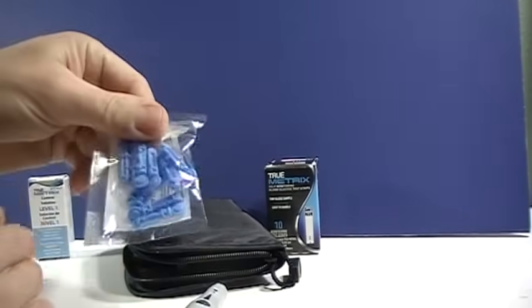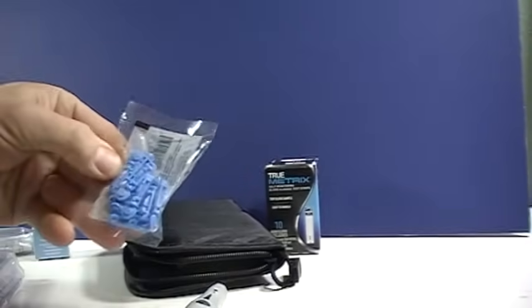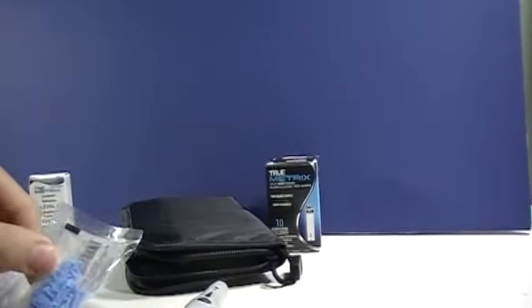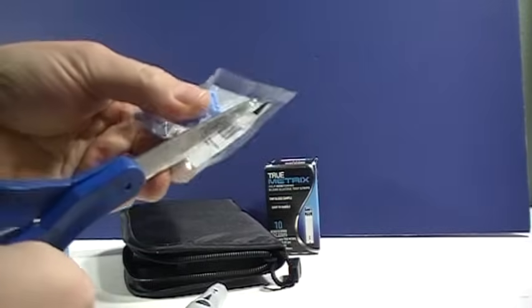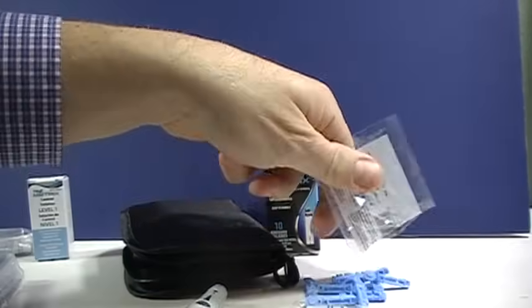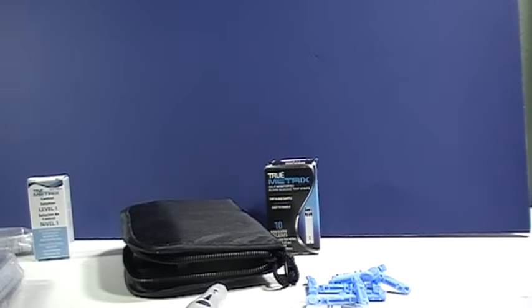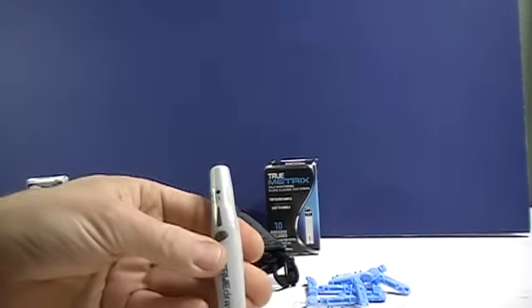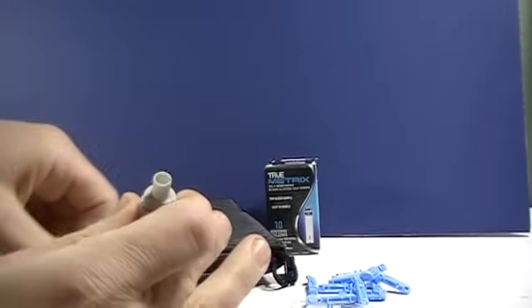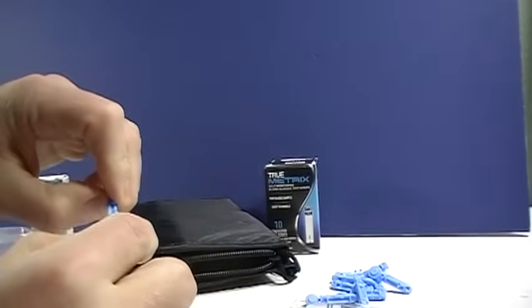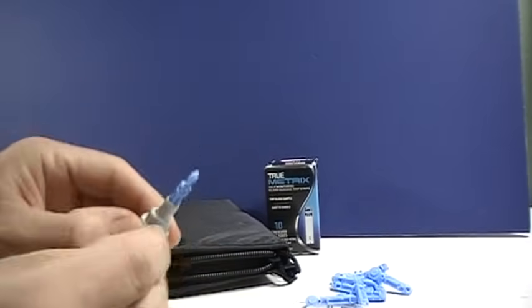These are the lancets. That's what you put in the lancet device to draw the blood. So first we can go over how to load the lancet device. Just remove the lid, put in one of the lancets.